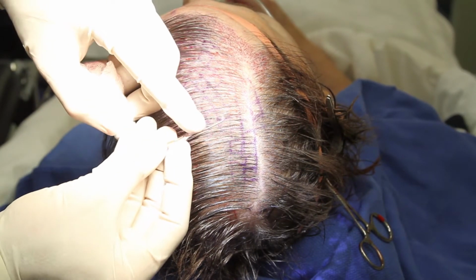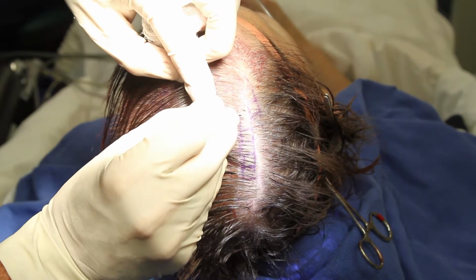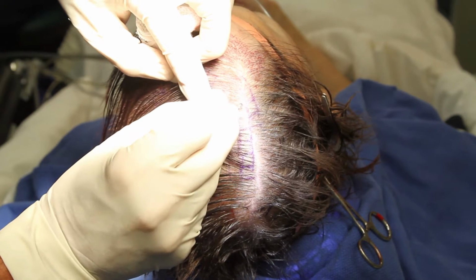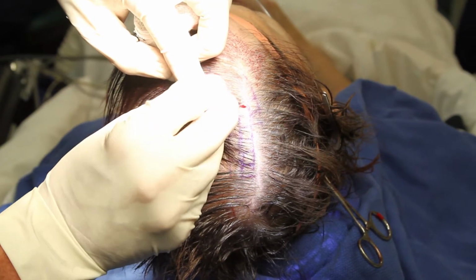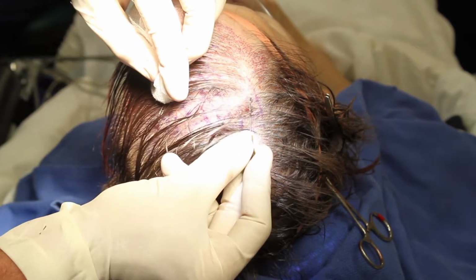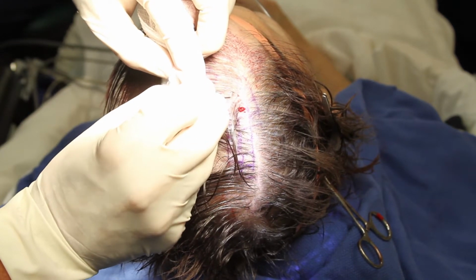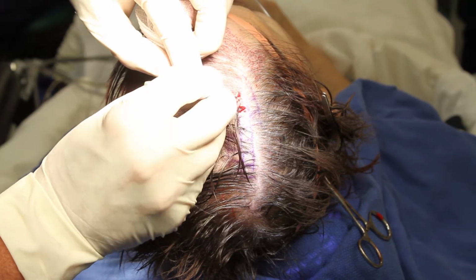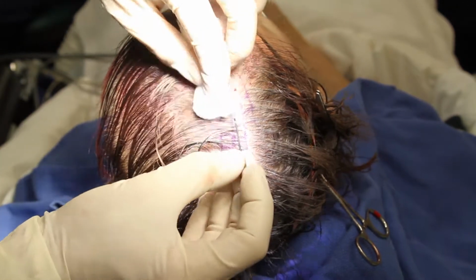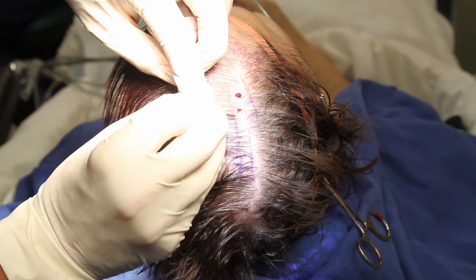This is basically a modified 19 gauge needle, one that you use for injecting someone with local anesthesia, and I'm going to place these little slits where they're needed in each one of these little boxes. And I've done my count, so I know how many we need to place. I know how many we need to get in here, going for that maximum density range at about 25 to 35 grafts per centimeter, and I'm going in between the existing hairs here to save every single hair follicle and every single hair shaft, not just the ones we're transplanting, but the ones that are already existing.